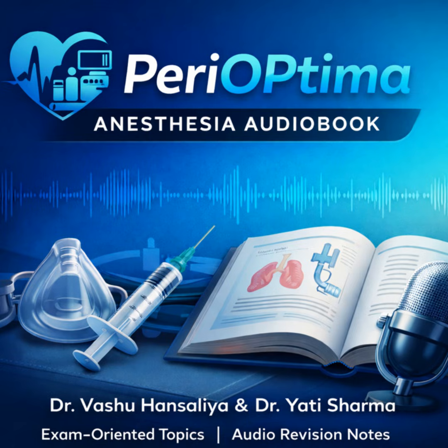The head looks like it's sniffing the morning air. That's the classic position. Is it different for neonates and children? It is, and that's an important distinction. Because of their proportionately larger occiput, their head is already naturally flexed. So often all you need is simple head extension or maybe just a small roll under the shoulders to get the alignment right. Okay, the patient is positioned.